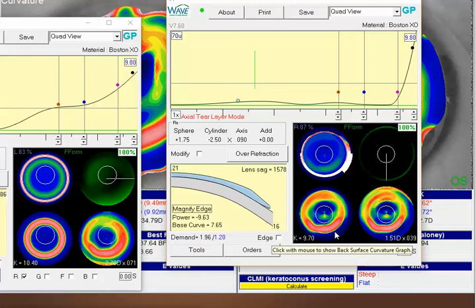Now, I found sometimes in these unique situations that I've almost had to go the full size of the cornea. In some of these cases, as you know, you've got a lot of stuff going on out here not too far from the landing zone. So sometimes if I can't get a lens to center or be comfortable or just lay nice enough, I'll take this diameter from about 9.8 and go all the way out to 11, sometimes almost the whole visible iris diameter. And I found in some cases I can get a very nice fit. Just a couple extra little thoughts.